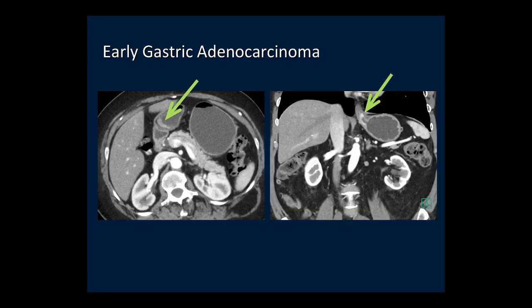Early gastric carcinomas are areas of thickening or ulceration on the gastric mucosa. Many hyper-enhance during the arterial phase of contrast enhancement. The example at the GE junction shows a small focal thickening of the mucosa that is hyper-enhancing, which was a gastric adenocarcinoma. Another image shows enhancing thickening of the mucosa at the level of the pylorus for a patient's adenocarcinoma.